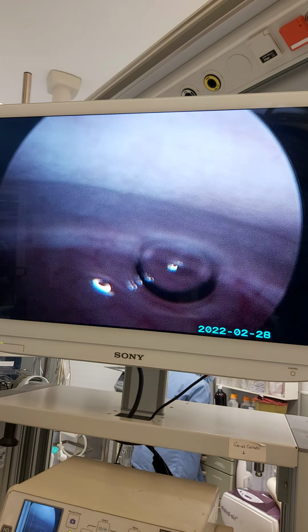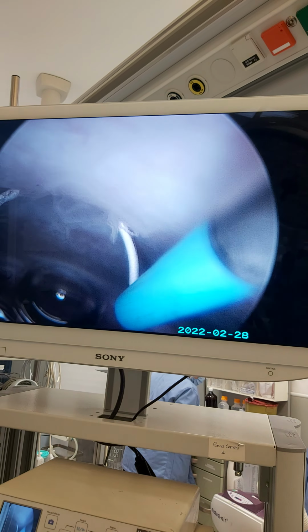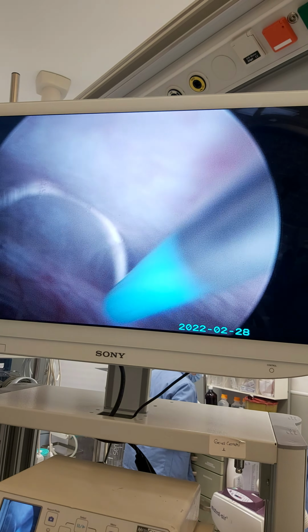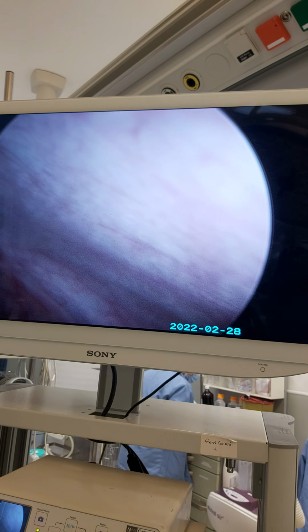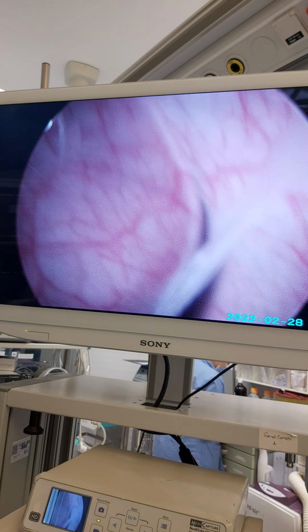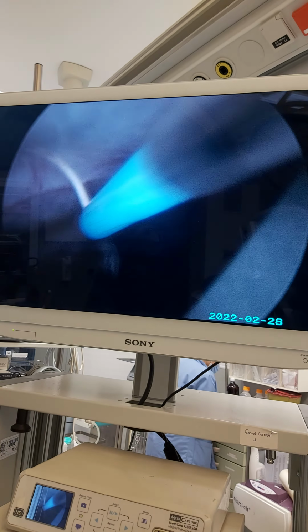These are also ill tissues. Look at the membranes. They prevent the bladder from a proper healing. These are healthy parts. In this front wall, it's a little more spread than I expected.